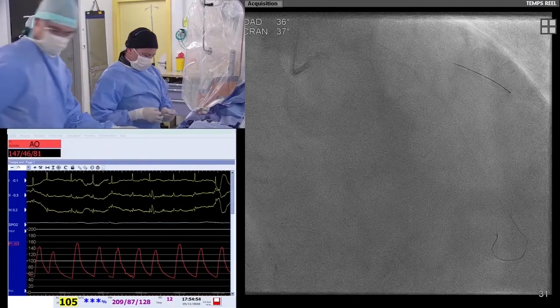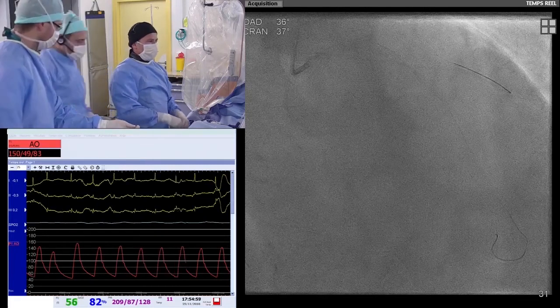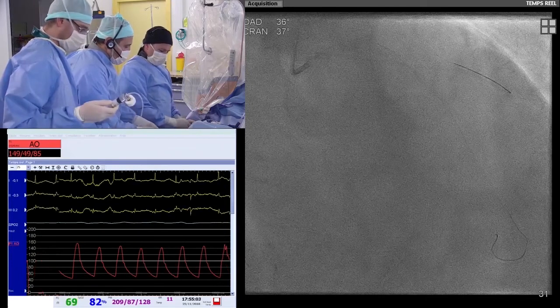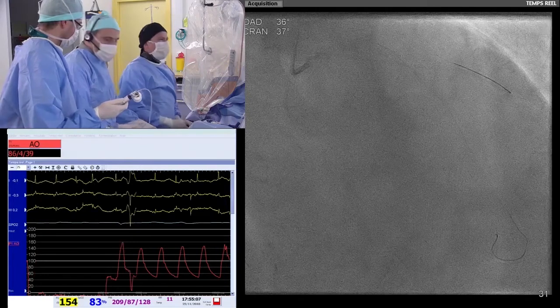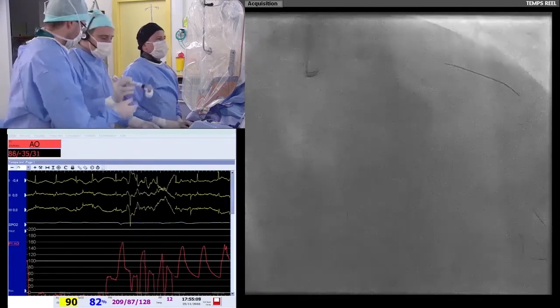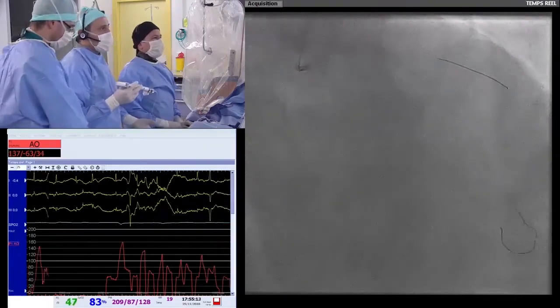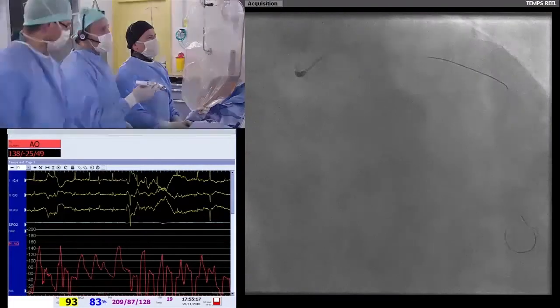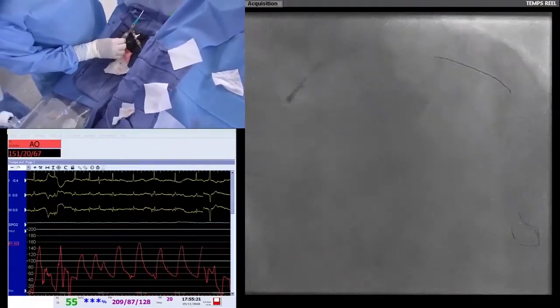There's a question about using a slightly smaller diameter stent with a view to post dilatation. Would that be easier? Well, I'm not sure whether it will be easier. The point is we have selected the stent size based on the diameter of the vessel at the landing zone. So we feel quite confident that a 3 is the right choice. And by the way, there is no major difference between 2.75 and a 3 in terms of type of stent.